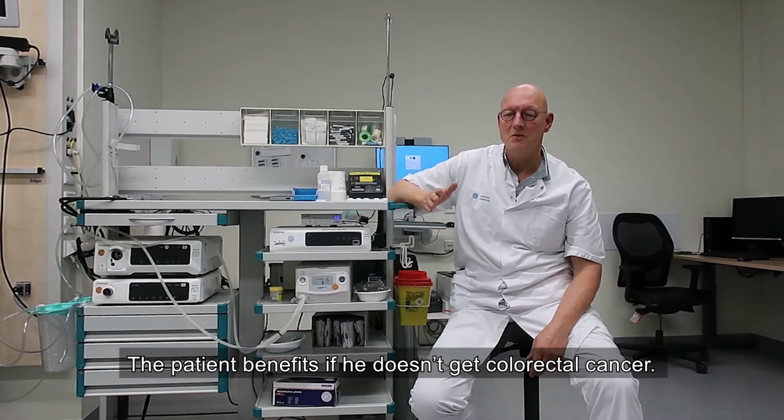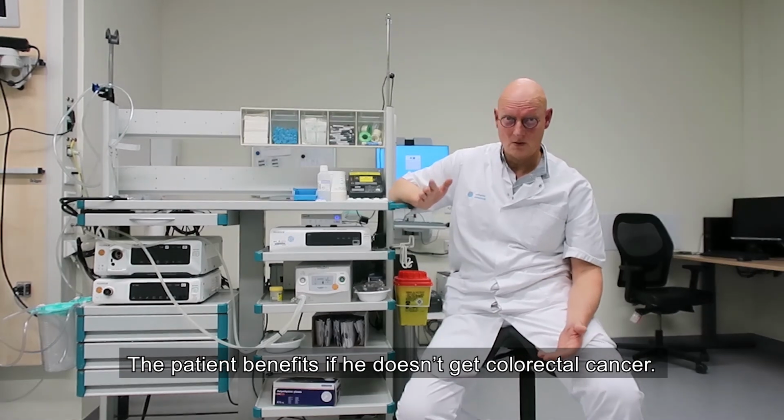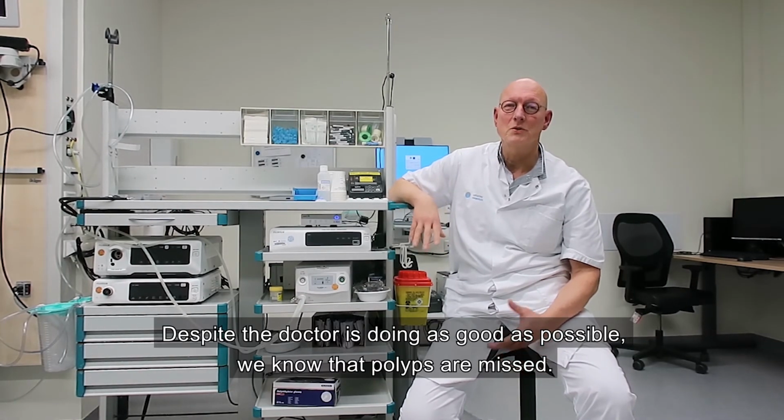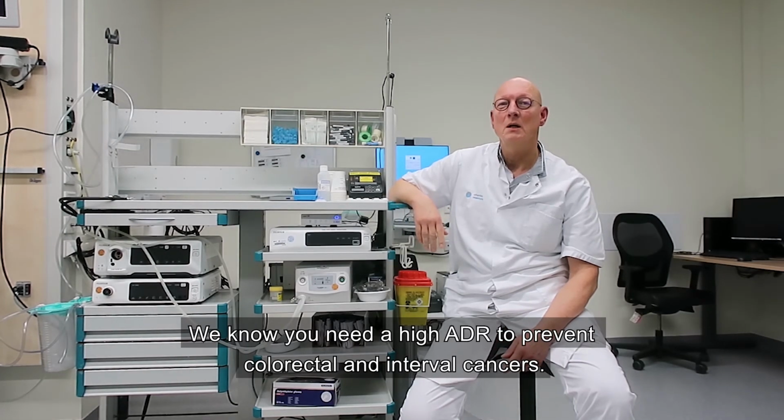Of course, the patient benefits if he doesn't get colorectal cancer, and despite the doctor doing as good as possible, we know that polyps are missed. We know that you need a high ADR to prevent colorectal cancer and interval cancers.